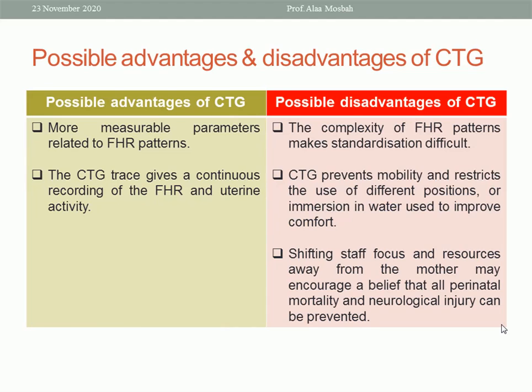If I wanted to do immersion in water to improve comfort, I cannot do that because of the electrodes and transducer fixed to the abdomen. This is one of the disadvantages. Another disadvantage is shifting staff focus and resources away from the mother, which may encourage a belief that all perinatal mortality and neurological injury can be prevented.